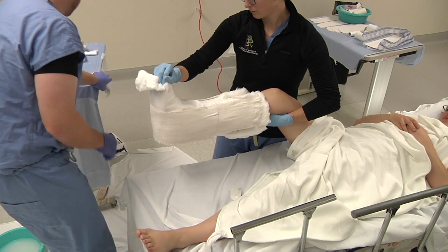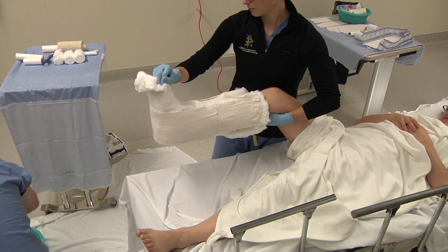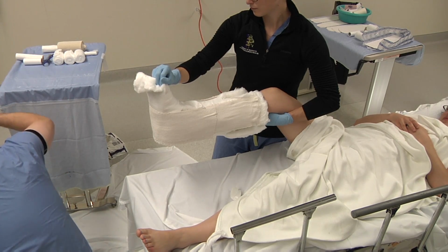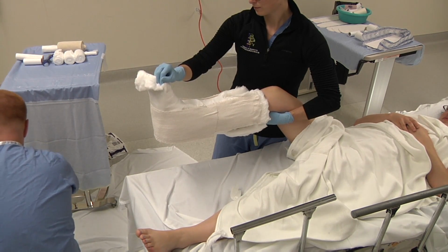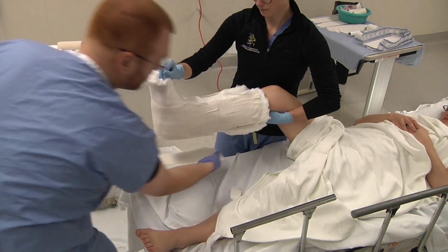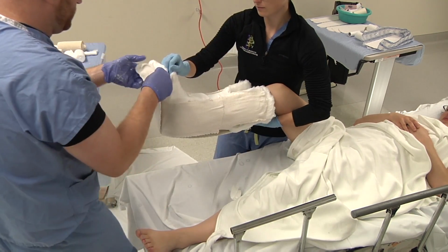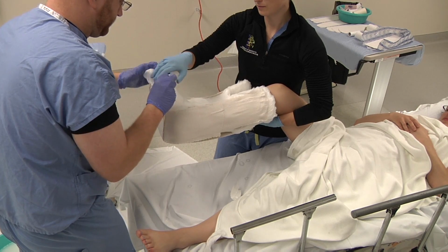Laminate these together. We then go to our posterior slab, which is 10 thick of our 5-inch by 30-inch plaster. Put it together. Really laminate it together. And you have your holder grasped at the bottom as well as at the top.